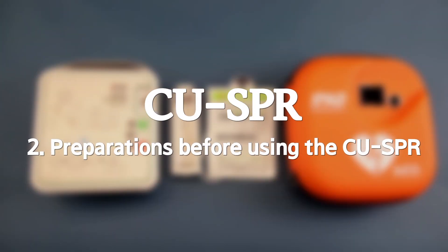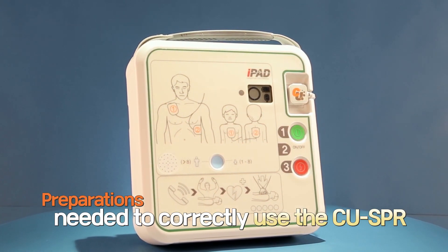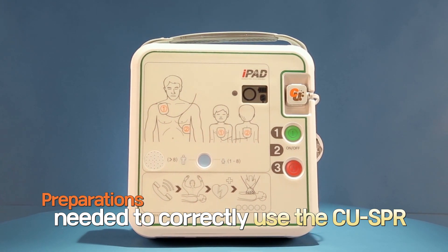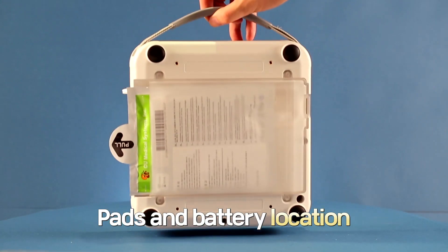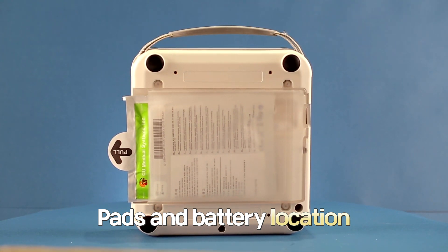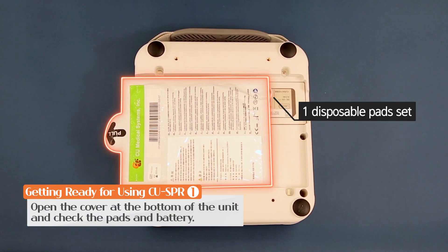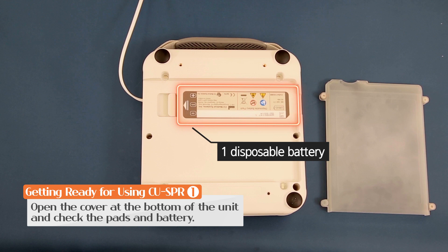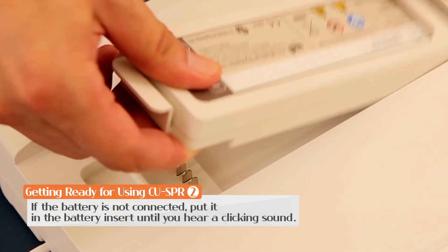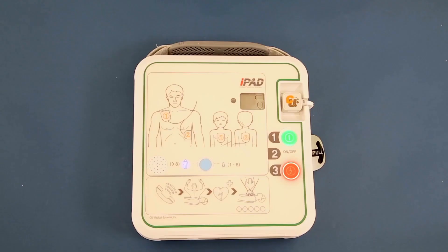Preparations before using the CUSPR. Simple preparations are needed to use the CUSPR correctly. The battery and pads can be found at the bottom part of the device. Open the cover at the bottom to find the pads and battery insert. If the battery is not connected, put in the battery insert until you can hear a clicking sound. Once the battery is inserted correctly, a self-test will begin.